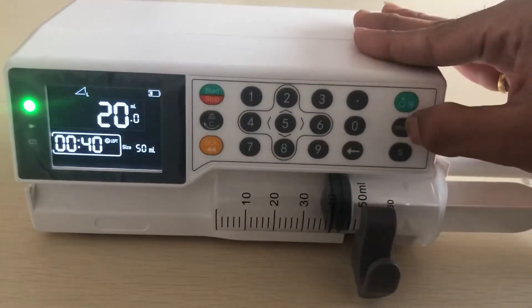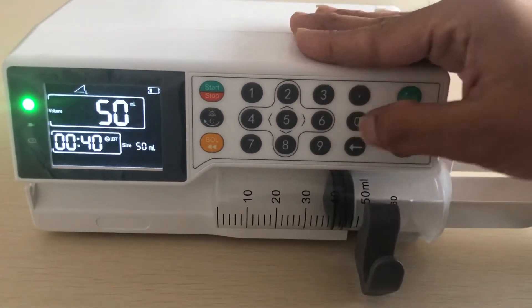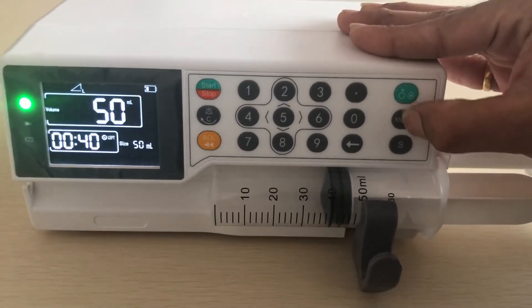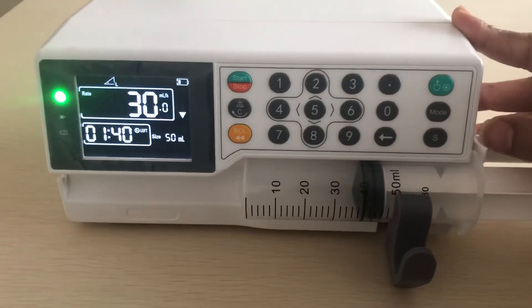This is volume — select the volume, double press. Then volume is 50 ml. Then select. Then start, the rate is 30.